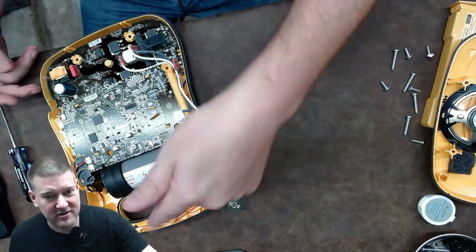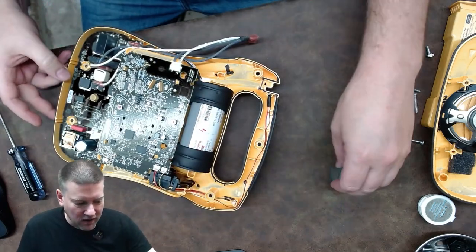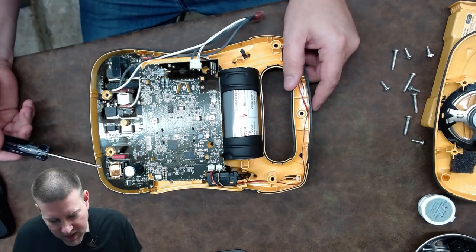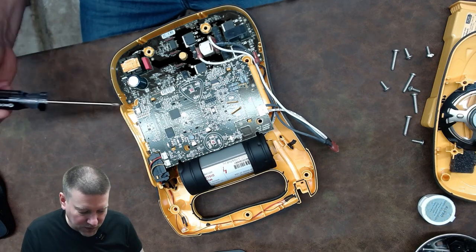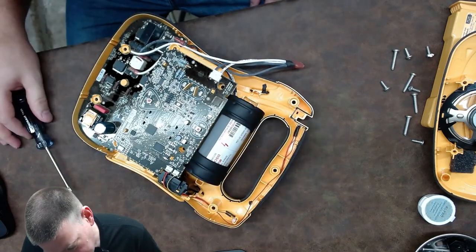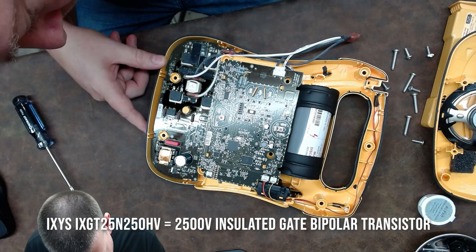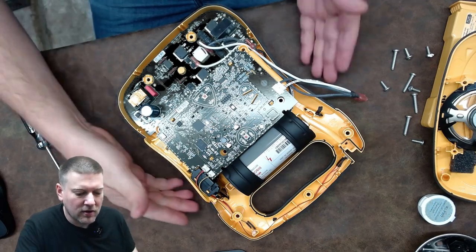Inside we have a very large capacitor, which I was expecting. There's a control board and a power management board. You can always tell the difference: the power management board will have voltage regulators, a load resistor, and what looks like a step-up transformer. Anytime you see a transformer and a large capacitor together, there's a voltage rail there. We also have some massive drivers — these are IXYS XGT25N250 components. These are your drivers that deliver the punch.